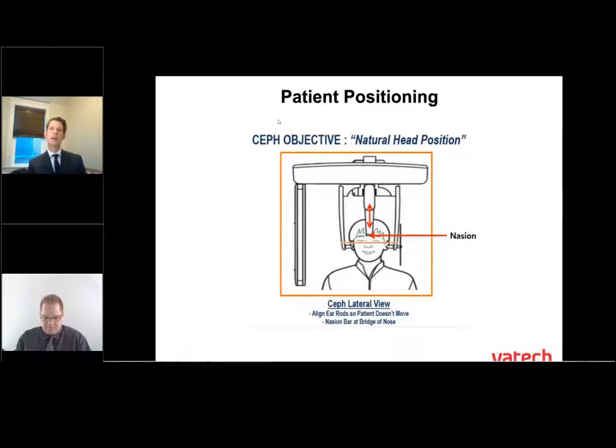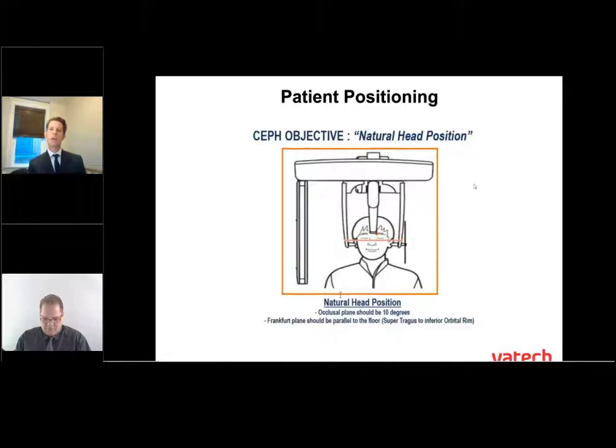Similar to the pan, we have our natural head position here. So we do want to make sure the patient's head is slightly tipped down. However, I do not have any beams on there, so we do look from a side view or a lateral view, have the patient smile and look at their head slightly tipped down, ensuring that the patient is standing up straight and those ear supports are tight.